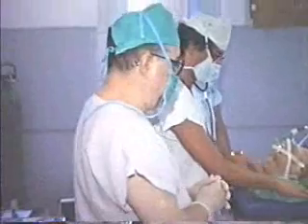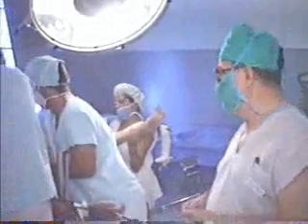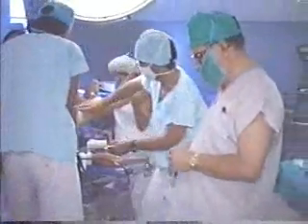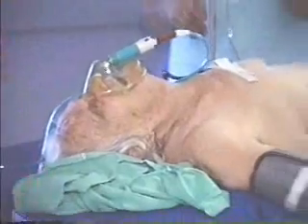Now let's wait — about one minute. We have an injection. The block can be assessed — it's often fast, in three or four minutes we are going to have complete anesthesia to T10 level. You can see she is being manipulated and not in discomfort.